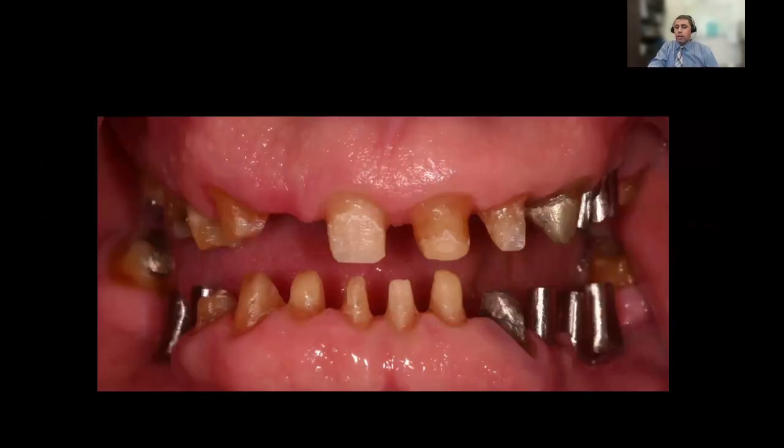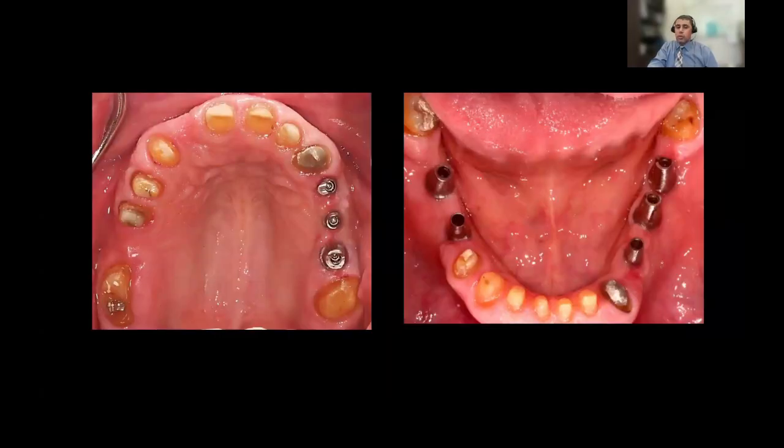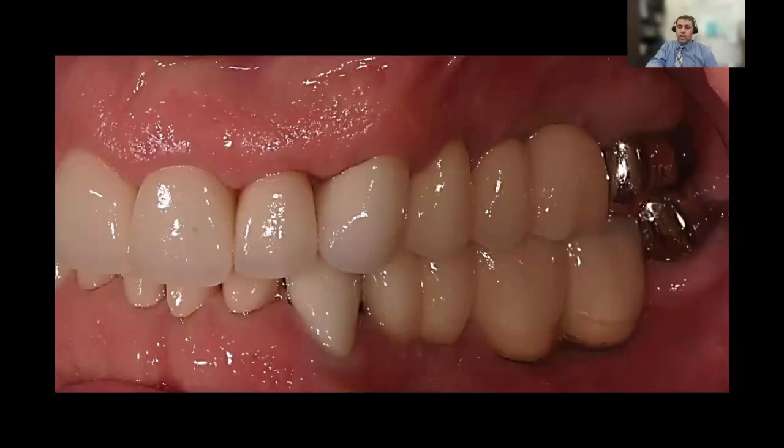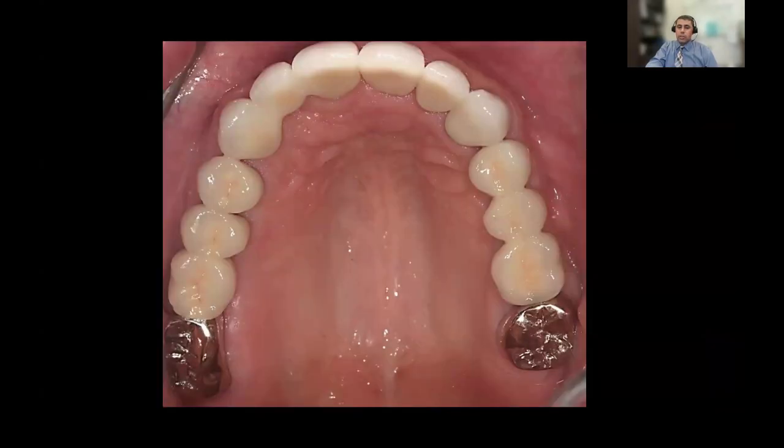So here is the picture of the tooth preparation. The implant abutments, those were stock abutments at the time. We were not using as many custom design abutments, but notice how we maximized and over-engineered the number of implants there. This is the insertion visit where the prosthetics were placed, and we can appreciate the occlusion for this patient. And again, we can achieve a very nice aesthetic outcome for the implants with a cement retained restoration, beautifully done restoration for the patient.